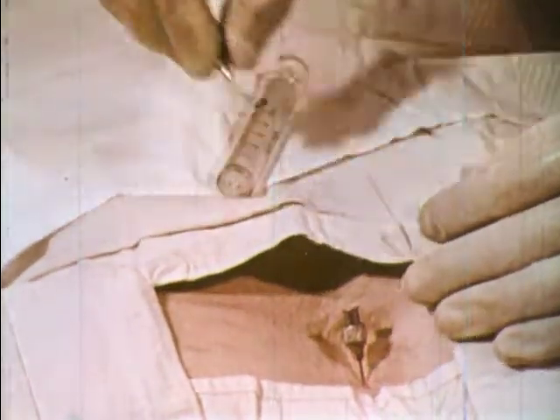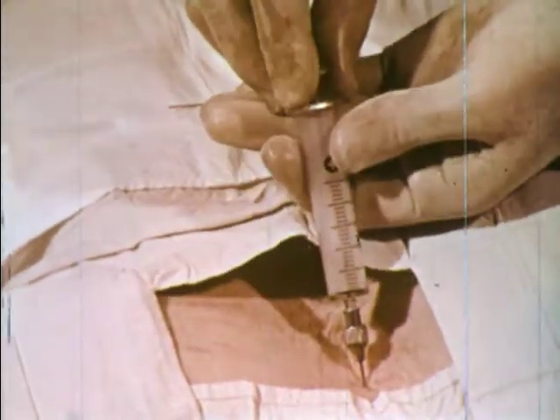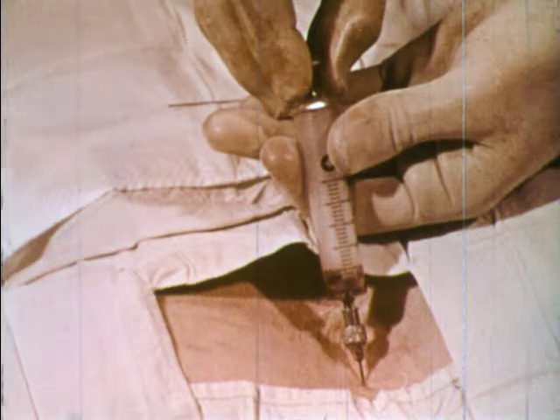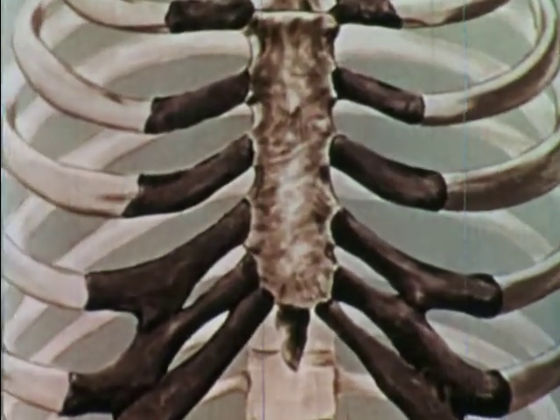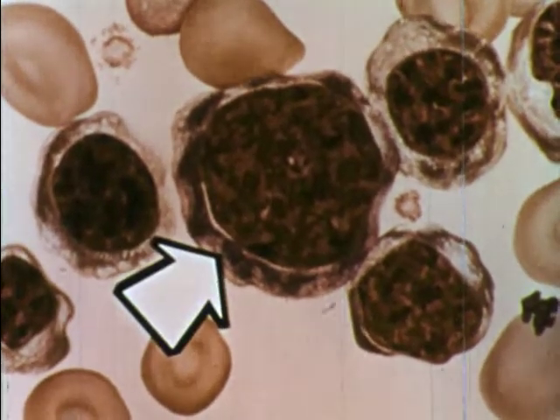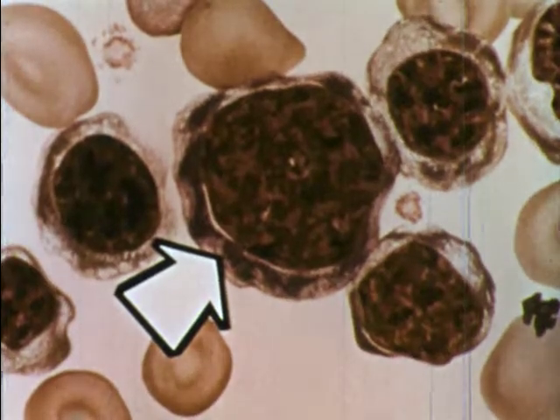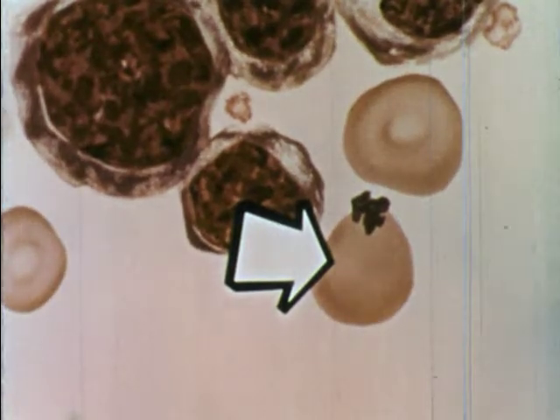Here we see the taking of a sample of live bone marrow. This is commonly done to study the performance of the blood-making mechanism of the body. This is a diagram of the breastbone from which the sample was taken. Here you can see many new cells in different stages of development. The dark cell in the center is an early stage of a red cell. At this stage, it contains a nucleus. Eventually, the red cell loses its nucleus before entering the bloodstream.